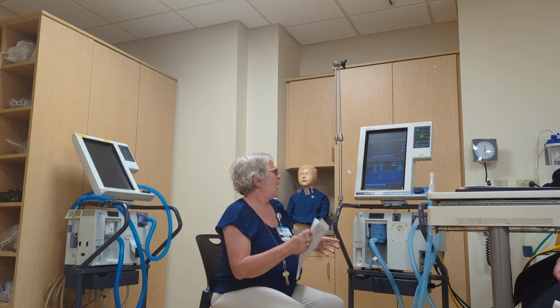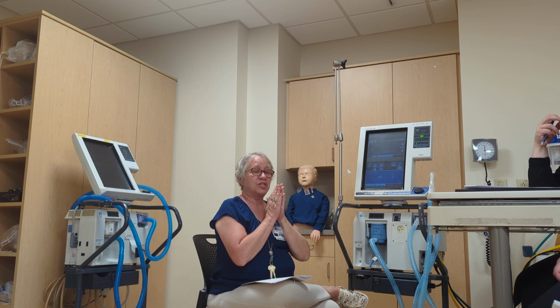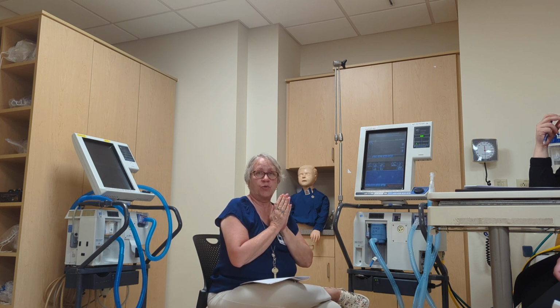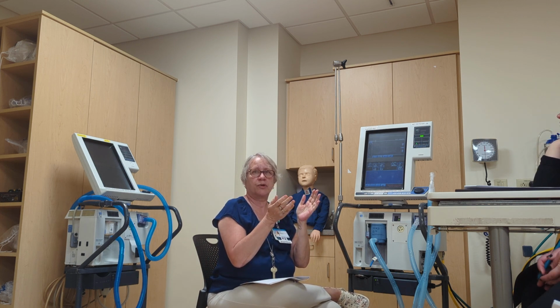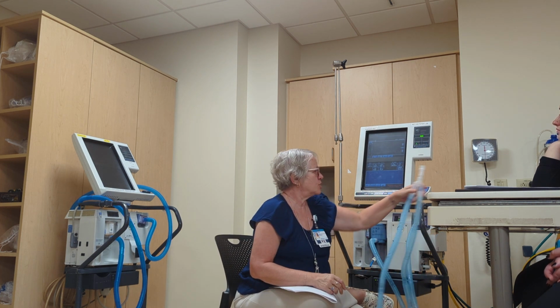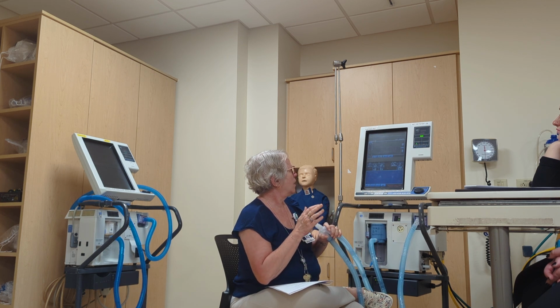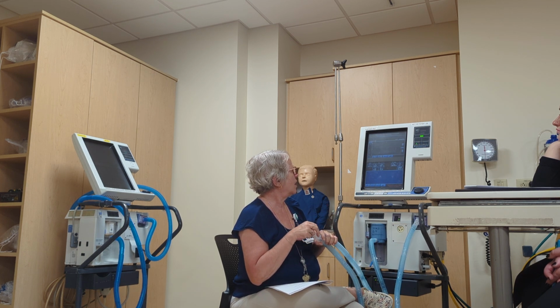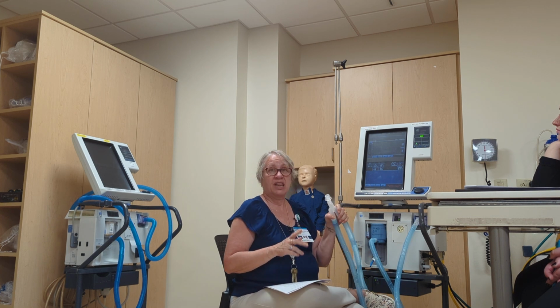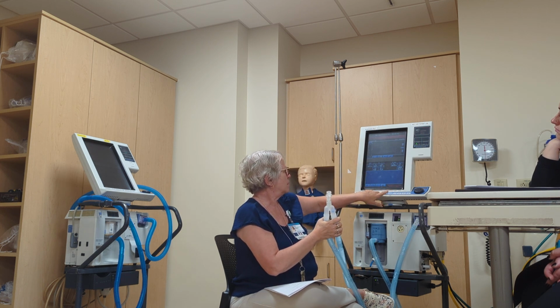And then I'm going to get it breathing, okay? So my change in volume will be 0, 200, 0, 200, right? I'm going to plug this and you're going to read my peak inspiratory pressure up here.